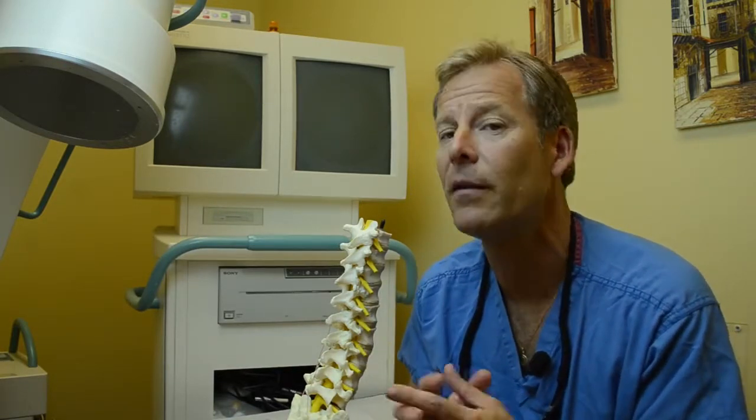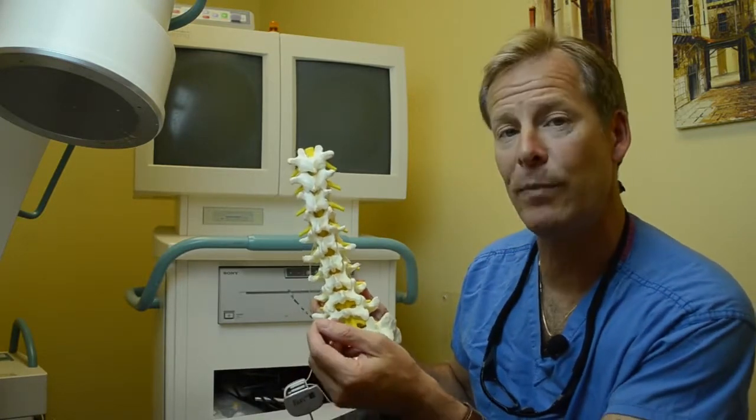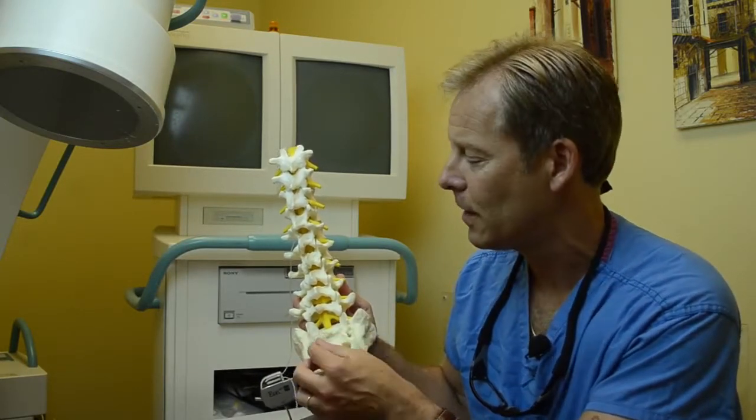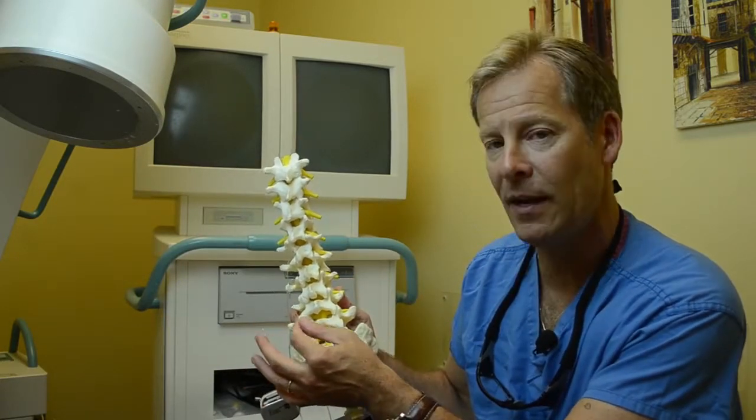So how's the procedure done? Fairly straightforward. This here's a model of your spine. The leads that would normally be placed in the spinal space, as in traditional spinal cord stimulation, are not placed there. They are simply placed in the subcutaneous tissue overlying the area of pain.